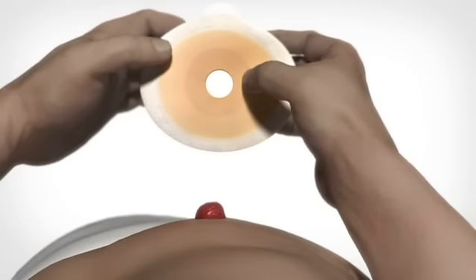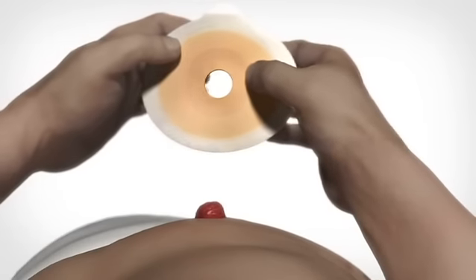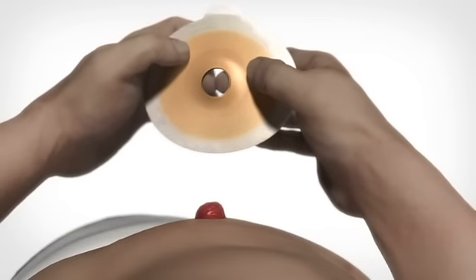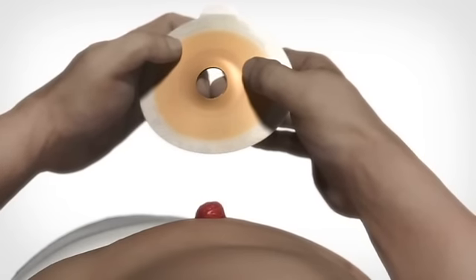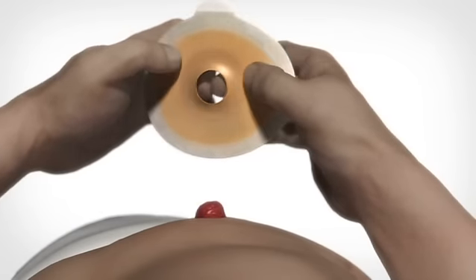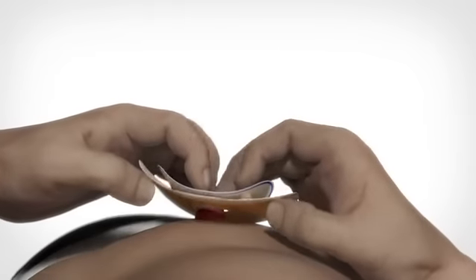When applying the adhesive to the skin around the stoma, it must make full contact with the skin. Before applying the adhesive to the skin, form the edge of the hole in the adhesive to a spout shape to face the skin.